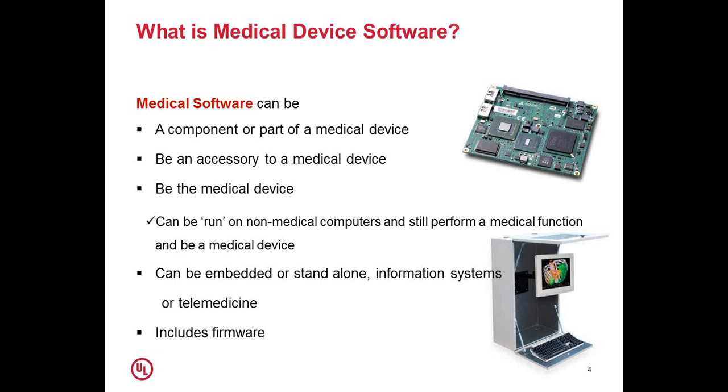There is a misconception among medical device manufacturers about whether a firmware or an embedded system becomes a part of the medical device software, and whether we should apply all the relevant regulations and requirements of IEC and ISO standards applicable for software. For that, the answer is yes, firmware also. We will discuss further during the course of this webinar.